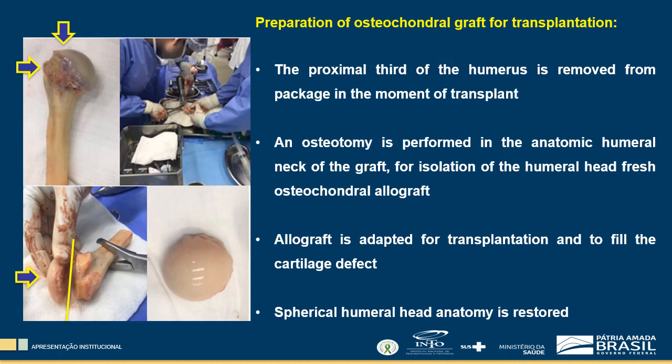At the time of surgery, an osteotomy is performed in the anatomical neck of the graft for isolation of the humeral head fresh osteochondral allograft, which is adapted for transplantation and to fill the cartilage defect, restoring the spherical humeral head anatomy.